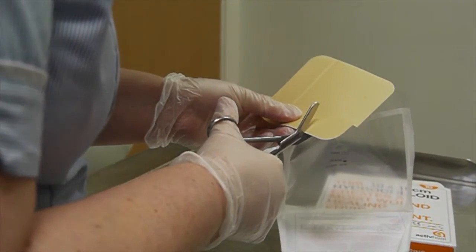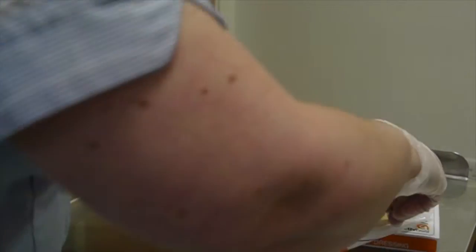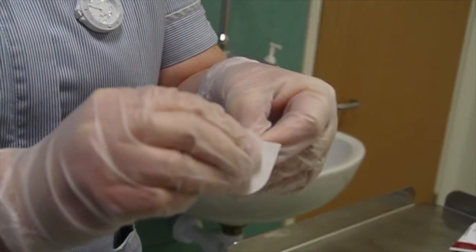If this isn't done then the hydrocolloid obviously won't stick, because there's not enough skin for it to stick onto.